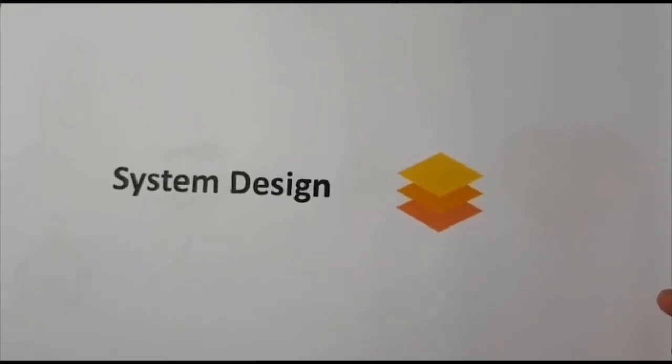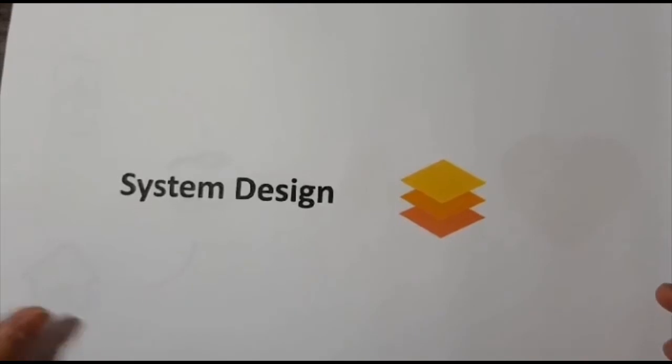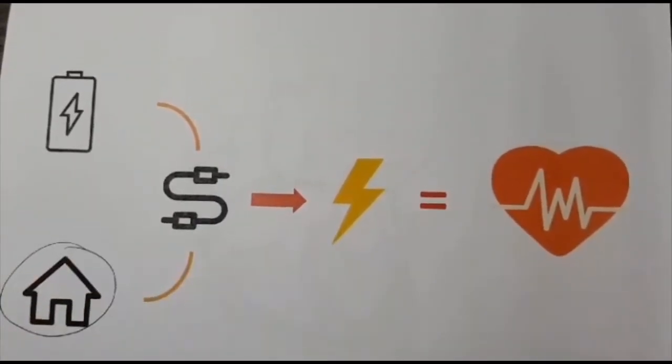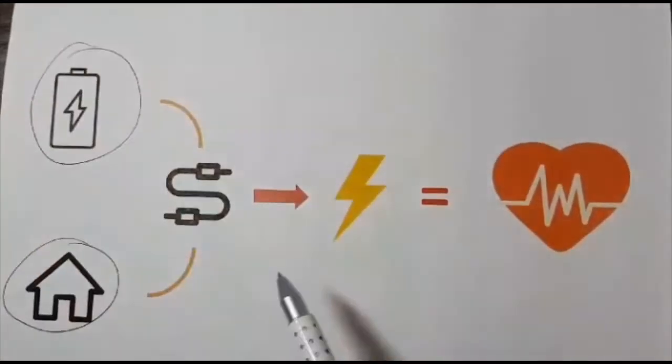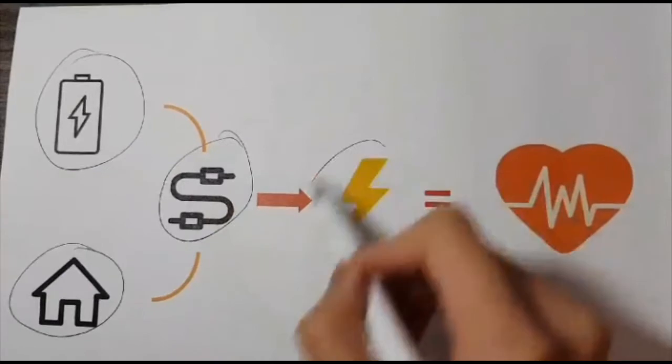A pacemaker is an implantable device that uses electrical impulses to stimulate the heart to correct any abnormalities in its heart rate. Simply, a pacemaker consists of a thin metal case housing a battery to power a computerized generator that sends electrical stimuli down wires through electrodes into the heart.